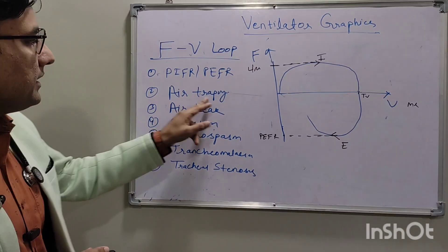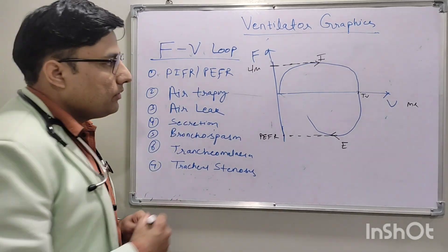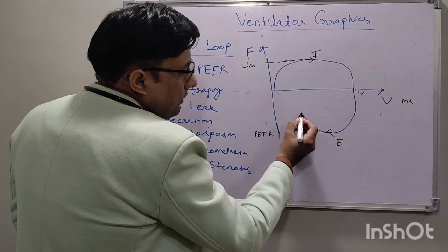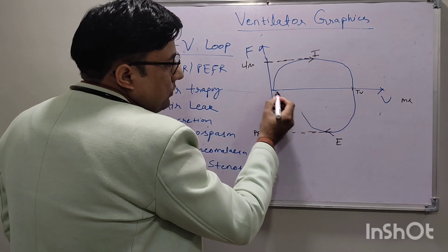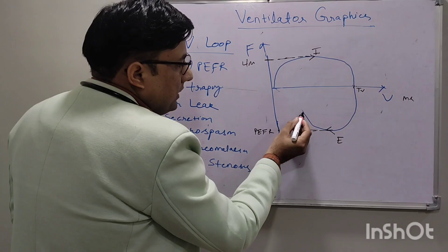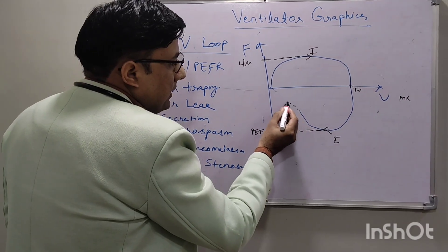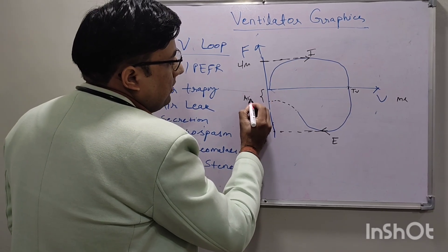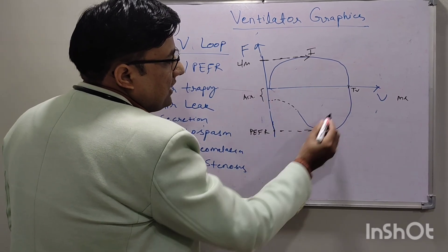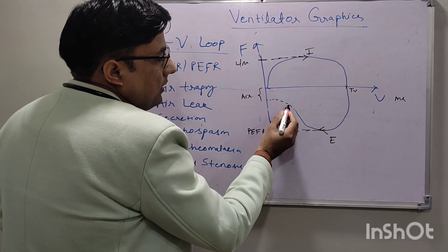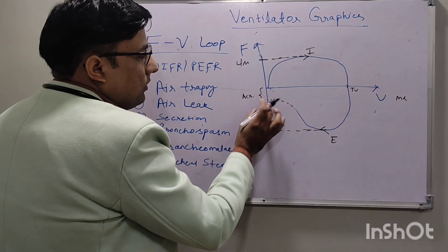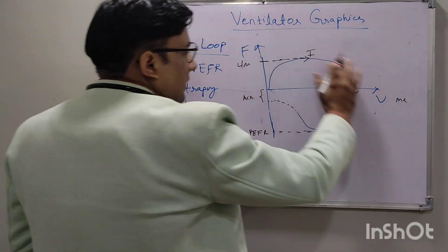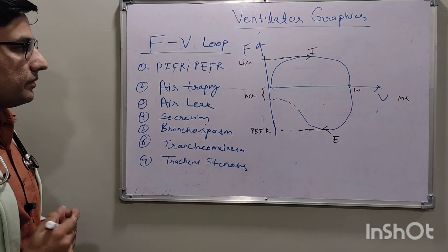In the flow volume loop we can see air trapping. In air trapping, the expiratory curve will not reach zero — it will end here. This much air trapping is happening; the expiratory curve does not return to zero.